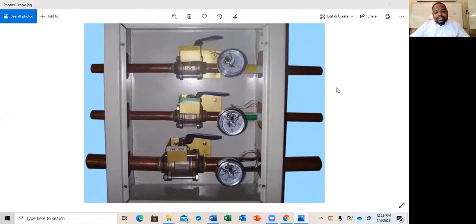All right. This is an example of a zone valve. Okay. The NFPA, National Fire Agency, or something like that. They are the ones that govern this, okay? You can notice by the colors, even if you couldn't read. Look right here. This is green. See that green little mark right there? That lets you know that this is the line that controls the oxygen in this zone, okay?